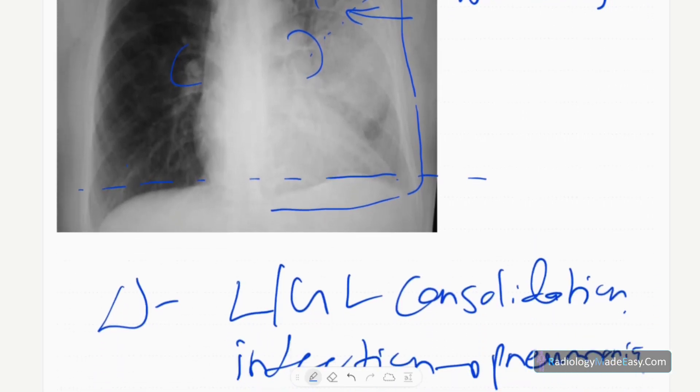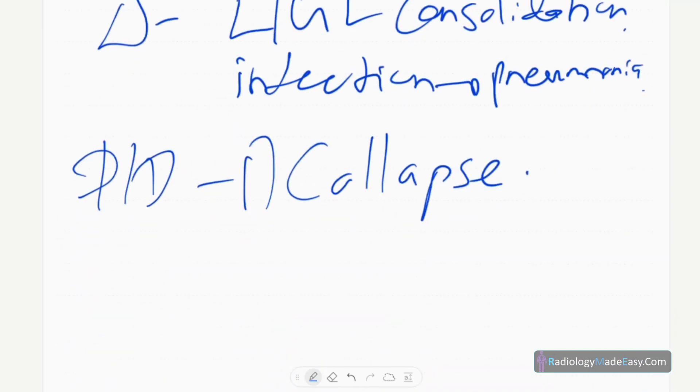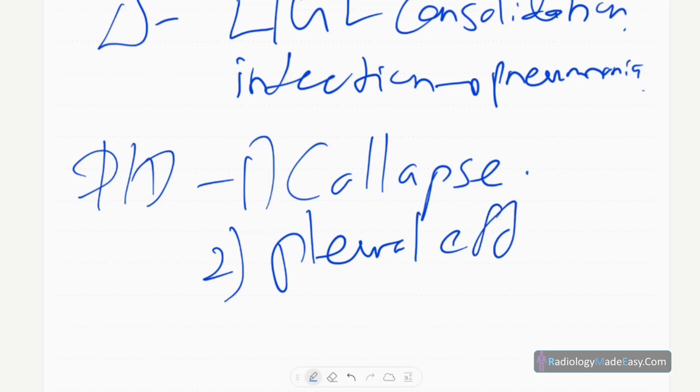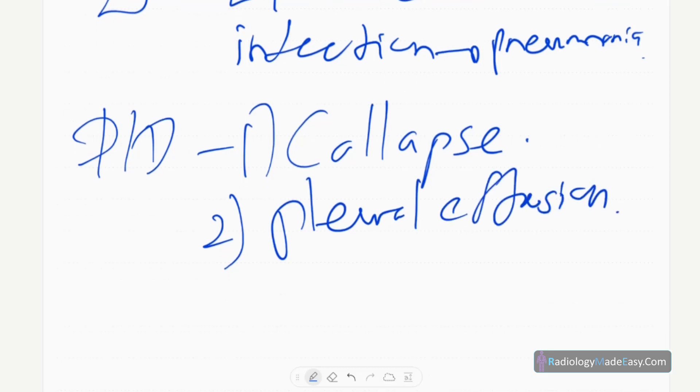Another differential diagnosis is pleural effusion. In pleural effusion, there's homogeneous opacification, no air bronchogram formation, and mediastinum tends to shift to the opposite side.